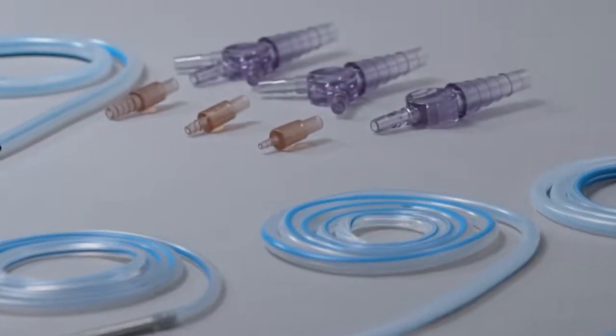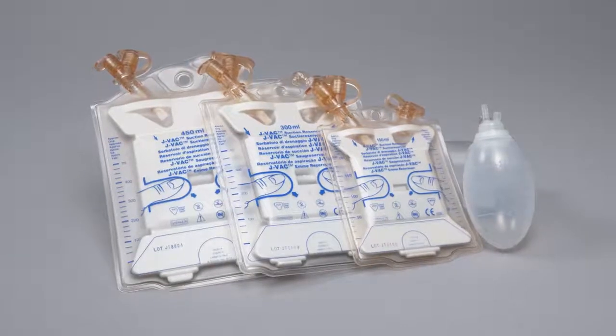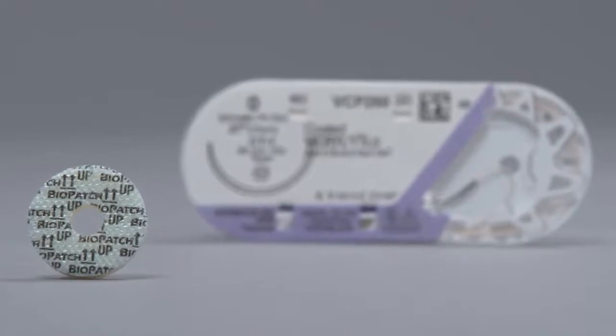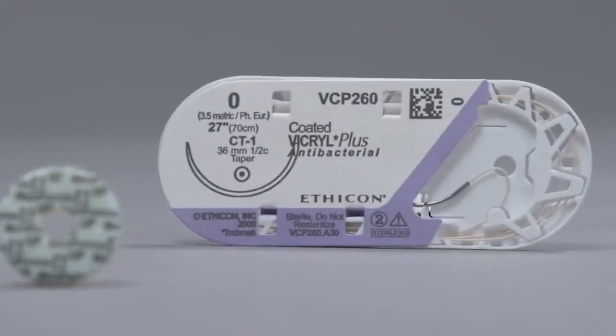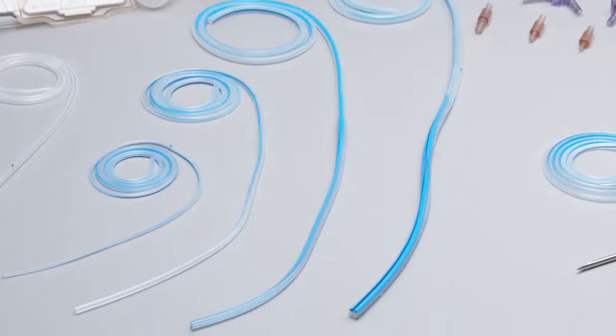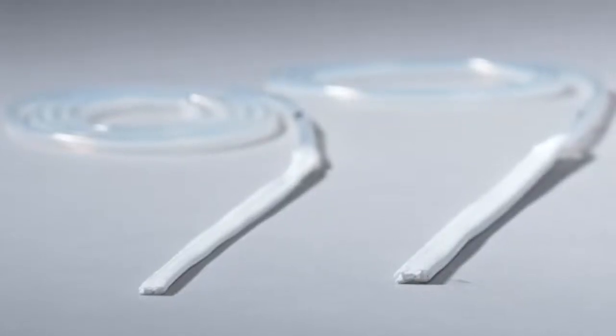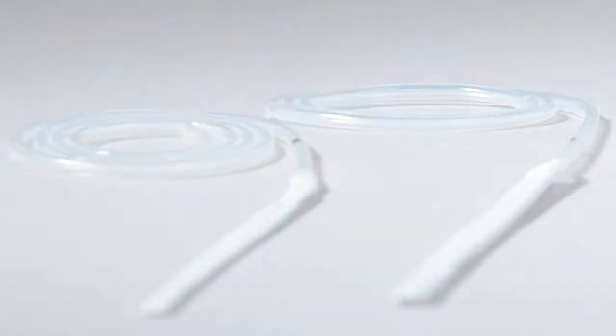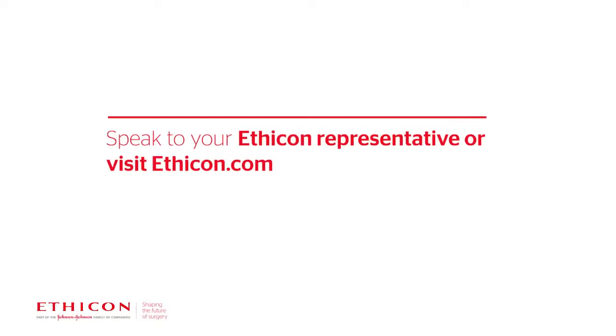Start to finish, the established leader in wound closure offers a complete portfolio that not only provides excellent drainage and greater patient comfort, it harnesses the benefits of two key products designed specifically for infection risk management. Blake drains are available in a wide variety of sizes in both round and flat drains, providing the right fit for every anatomical area and procedure. To order Blake drains, plus antibacterial sutures or Biopatch disc, or to learn more, speak to your Ethicon representative or visit Ethicon.com.